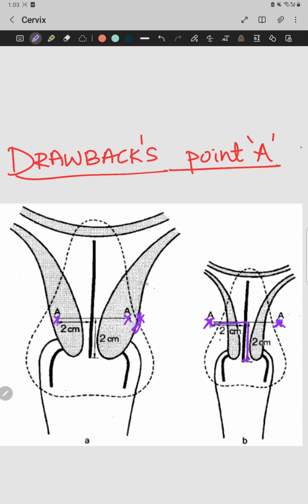So here still there is a cervix which is beyond the point where you have to prescribe. You have to prescribe at the paracervical triangle, right? So now it is inside of that. So here there is underdosing, here there is overdosing. So that's the drawback of point A.